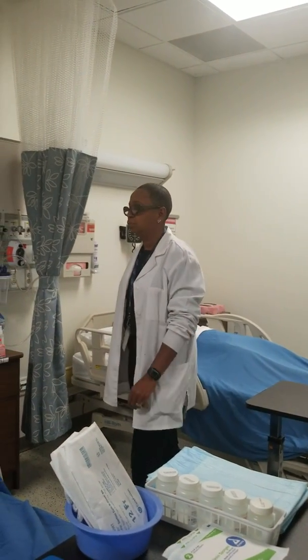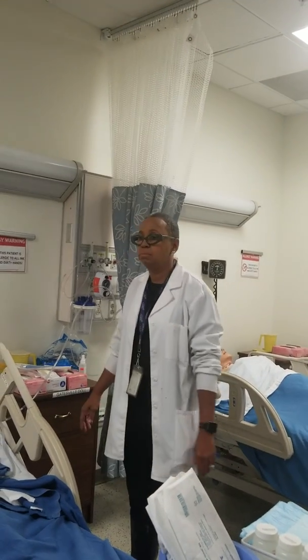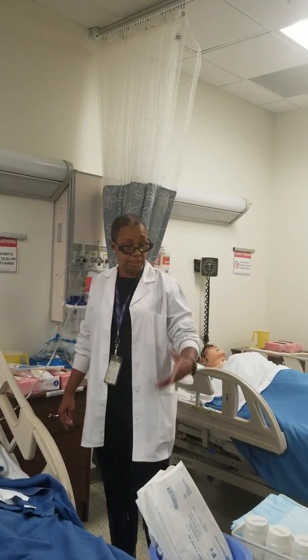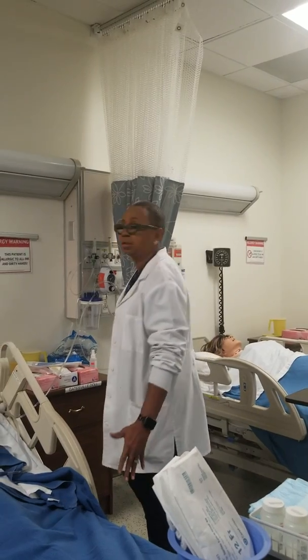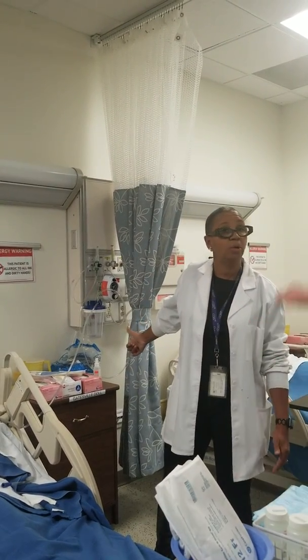Clean someone's trach is what? What would you have at the bedside? What do you set up? Oxygen. Yeah, I might need some oxygen, okay? You need your supplies, so you're gonna find out what your supplies are, if you need a trach kit, if you need a suction catheter. What else are you gonna set up? You're gonna make sure your suction is up, working, okay?